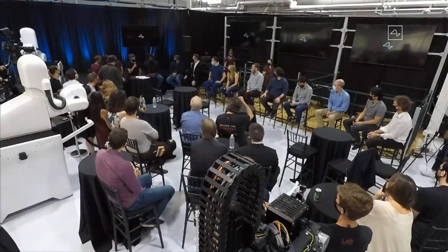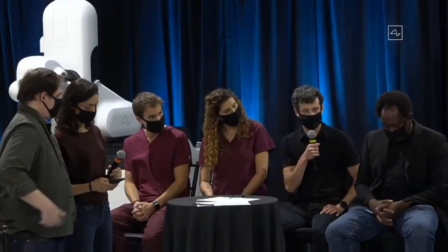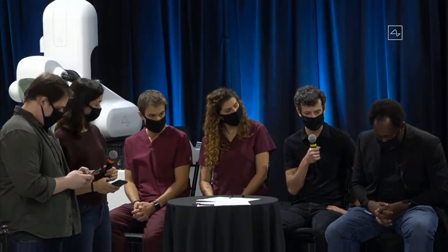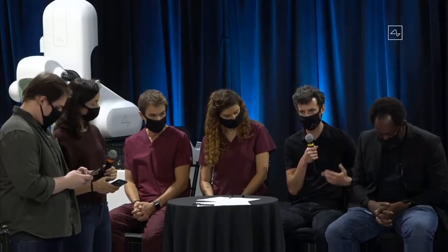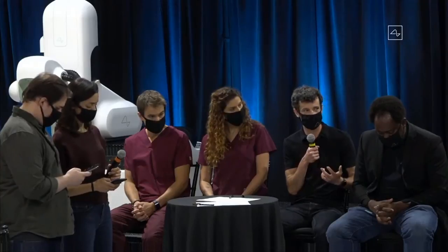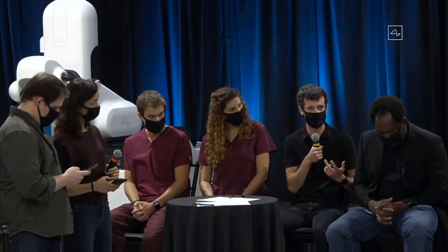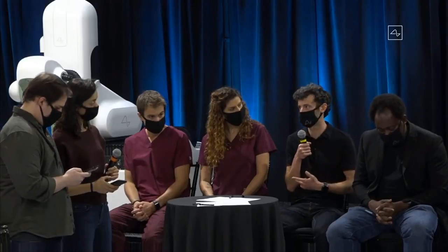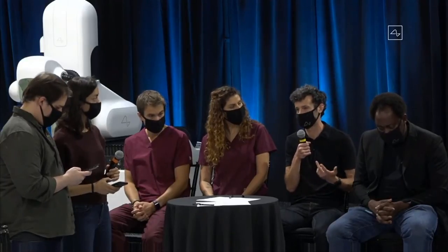Anyone? Yeah? So, hey, I'm Zach. I work on the microfabrication team. I help make implants. And one thing that I think is really cool, just in general, is that this is a platform, essentially, so we can change the design in a variety of ways. If we find that a certain design or electrode size or number of electrodes works better in different areas of the brain, we have the capability to do that. I personally think that's very cool.